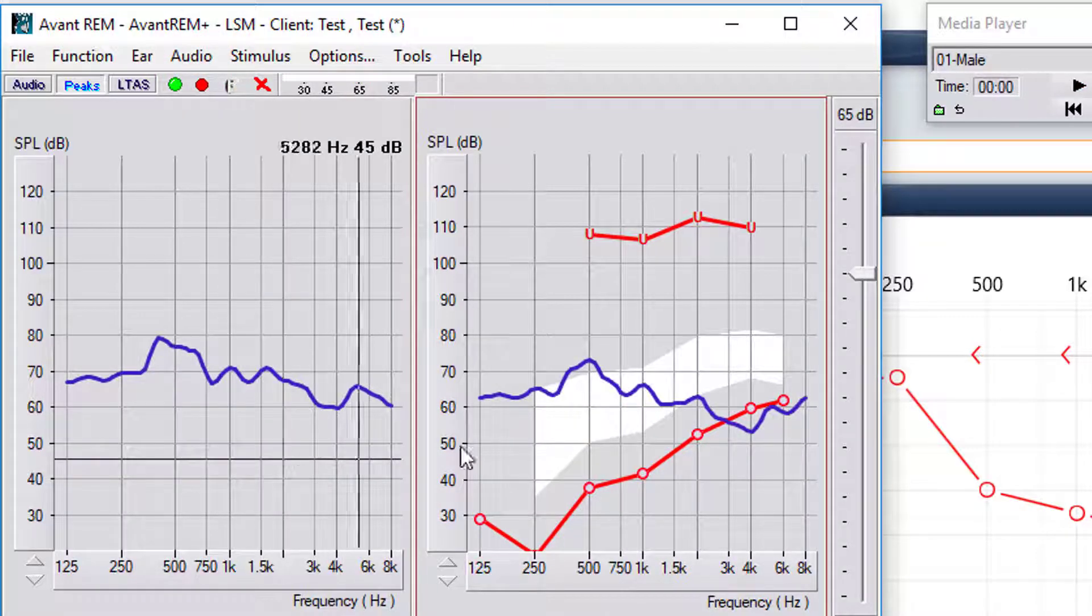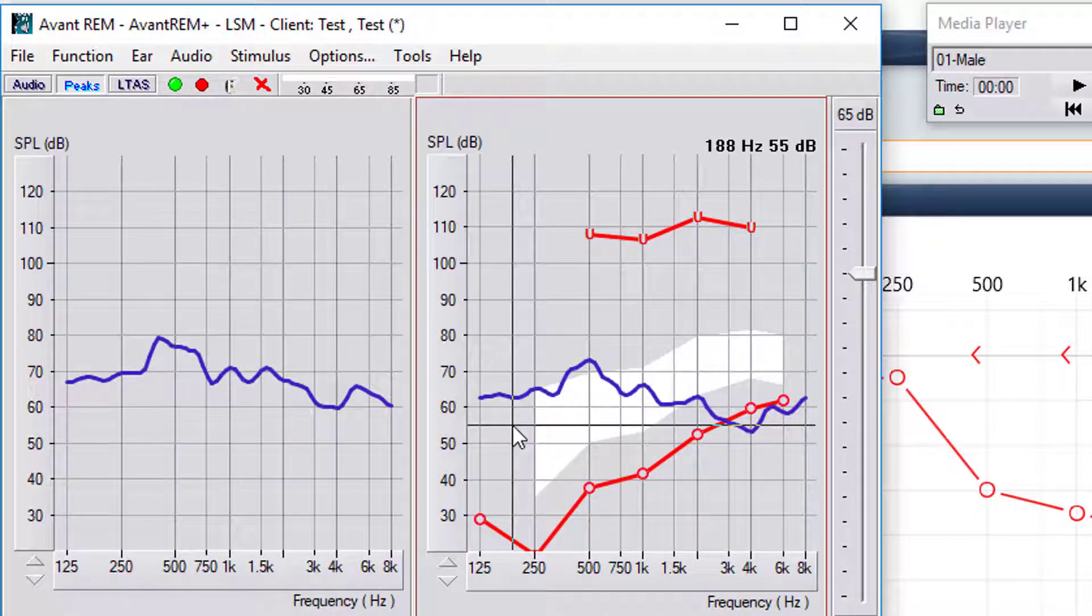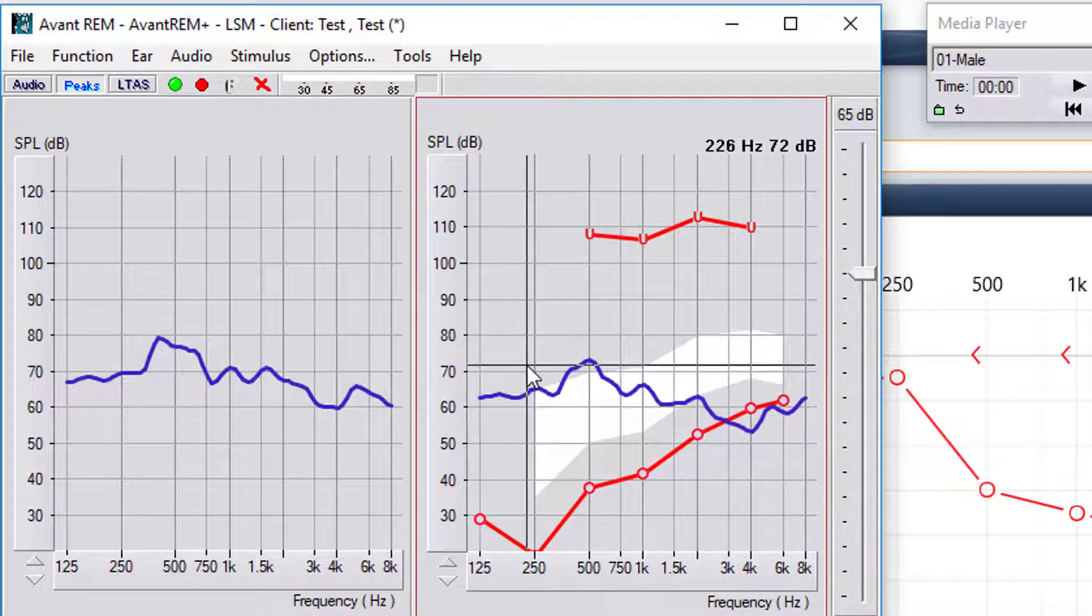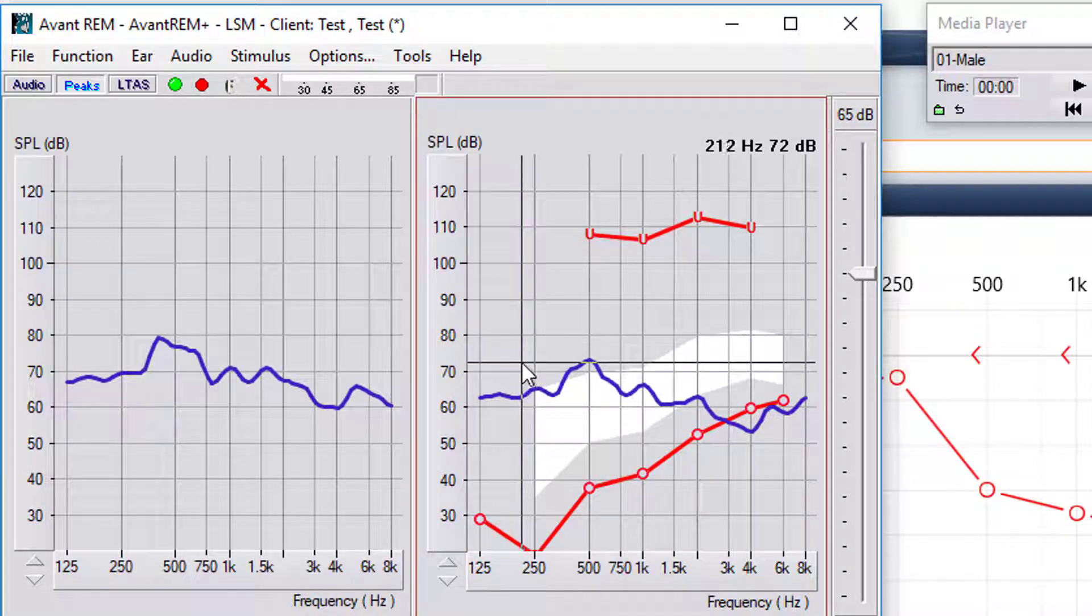This is our unaided response. There's no specific button that you have to press. It's just the probe tube in the ear without the hearing aid.